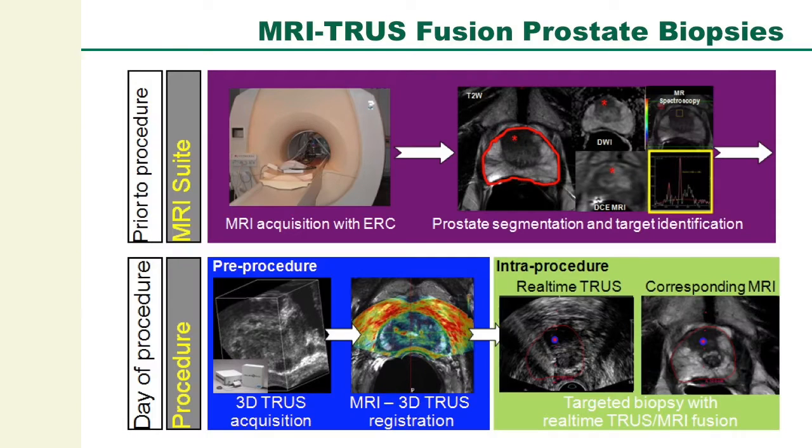And so the workflow for what you'll see is the patient will come in, they'll get the multiparametric MRI, we'll look at the prostate in a multidisciplinary conference where Dr. Rais-Bahrami and myself, as well as our radiologists who are experienced reading these, will look at these together in a conference platform and determine lesions of significance if there are any. And then the patient will come into the biopsy suite in a urologist's office, which is just like the typical biopsy that they've had before experience-wise.